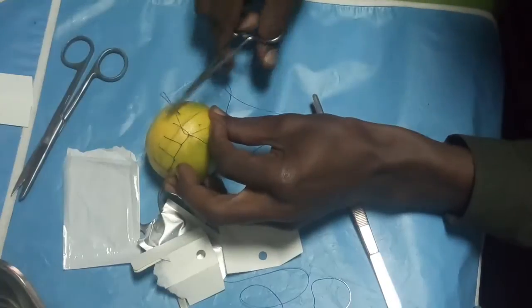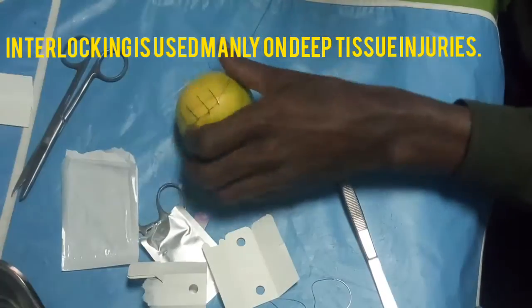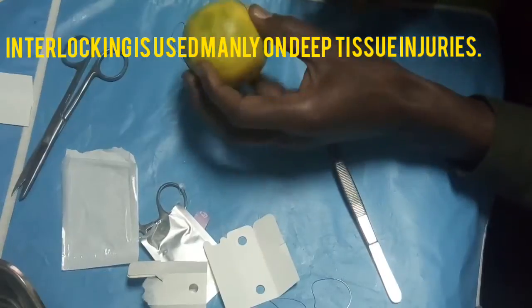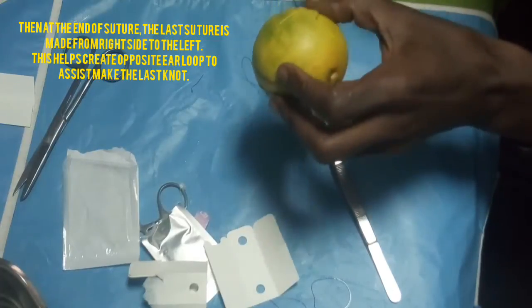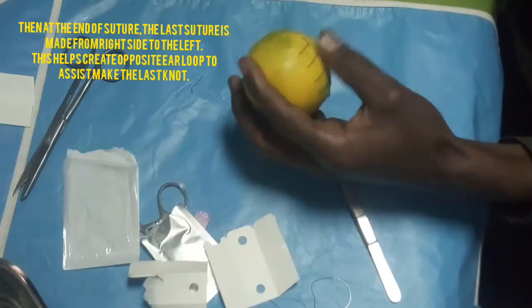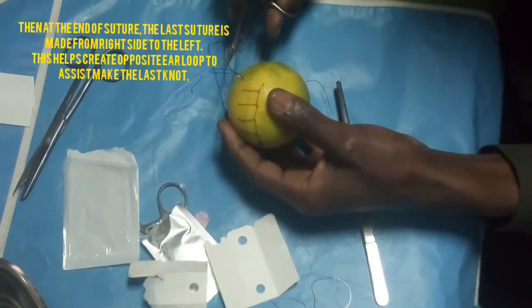This pattern, remember, is used to treat deep tissue injuries like a muscular tissue injury. Then after reaching this part, you just come to the opposite side. Then you interlock. After that, you come to the opposite side again so that we can make our last knot like this.